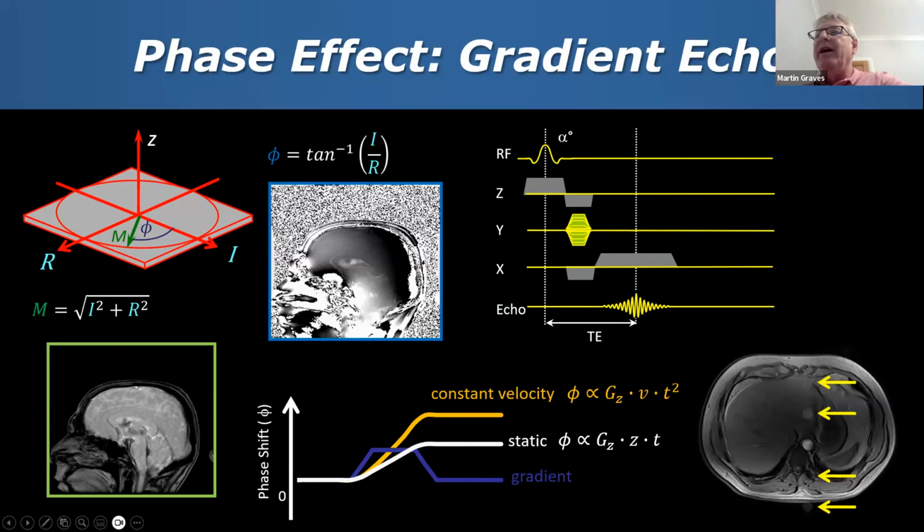Now, most of the low frequency variation, dark to bright, you may see over here is due to the fact that the magnetic field is not perfectly uniform. In fact, phase images are used as part of the shimming process. Here we can see there's lots of aliasing because this is phase data. And this aliasing is coming here because of the air tissue interface at the sinuses, and that also upsets the phase relationship. So we've got this phase information.